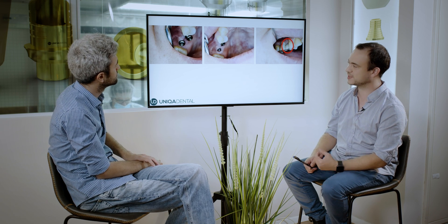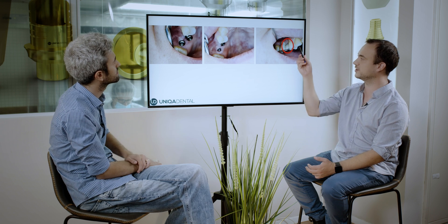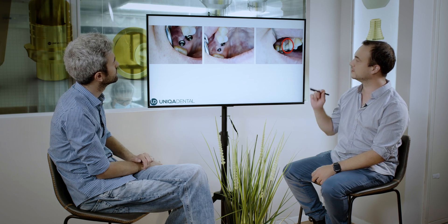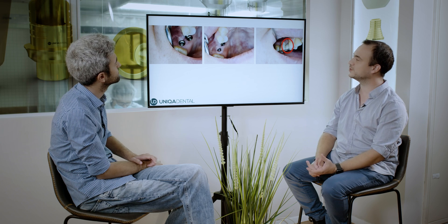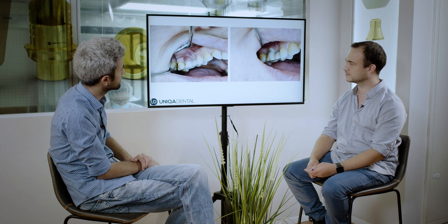This is after the healing process. You can see the gingiva — the color is pinkish-white. You can see the height of the multi-units is probably the same as before; this one is even a little bit above the gingiva, this one is a little bit below, but it's not deep like it was before. Here you can see the two crowns — this bridge mounted back. The right crown is really small. Could you use cement here at all in the beginning? Probably not, because you don't have enough space. For cement restoration you need at least four to five millimeters of crown height from the gingiva line, otherwise you can't make cement restoration.